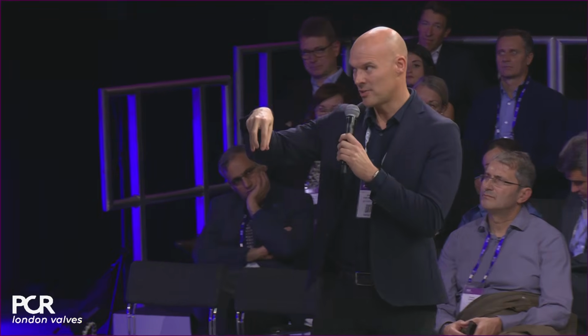Well, I must say that I'm not a proponent of the very high implants. I don't like a 0 millimeter implant, so that you really land on the annulus itself. In my opinion, you always need to go across the annulus. Because we not only think about coronary access, we also, if we think of the broader picture of lifetime management, think about revalving.